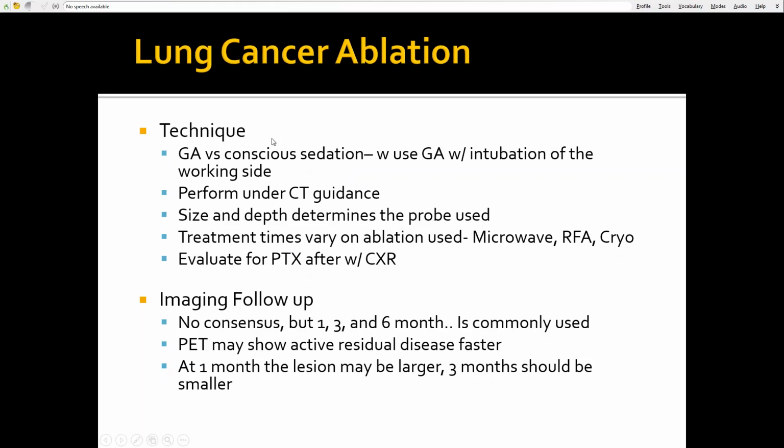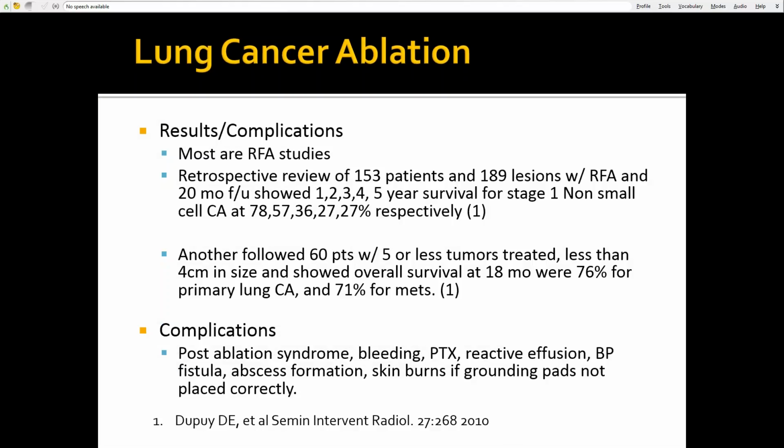talked about us doing this when a patient comes in, let's say it's a 79, 80-year-old female or male, that has a solitary tumor and it hasn't been diagnosed yet. Then go ahead and actually do the biopsy, but at the same time, since we know it's most likely a malignancy if it's increasing in size, go ahead and treat it in one session. So now we're trying to actually do both, where we biopsy and treat in the same day for these lesions.